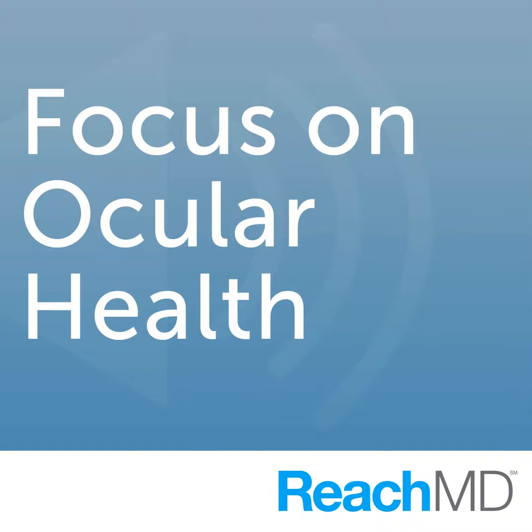Let's take macular degeneration. Talk about wet macular degeneration where there's actual leakage from the blood vessels. What does this show you in an untreated eye as opposed to an eye which has been treated either with laser or with an injection with an anti-VEGF substance? Okay, well, in an untreated eye, it will show you the presence of fluid, which causes the elevation of the retina.